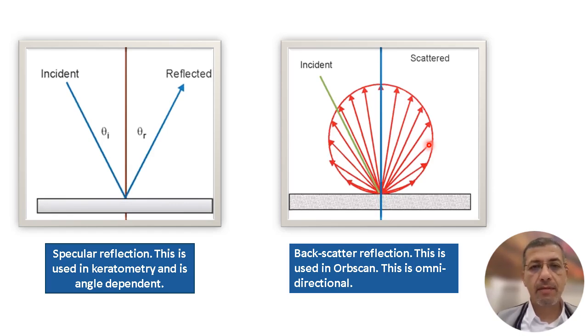I have good experience with Orbiscan 2, as it was available in the Tripoli Medical Center over the last 10 years. It has done a very good job, but it has some drawbacks and limitations compared to the new generations of tomographies that are currently available in the market.